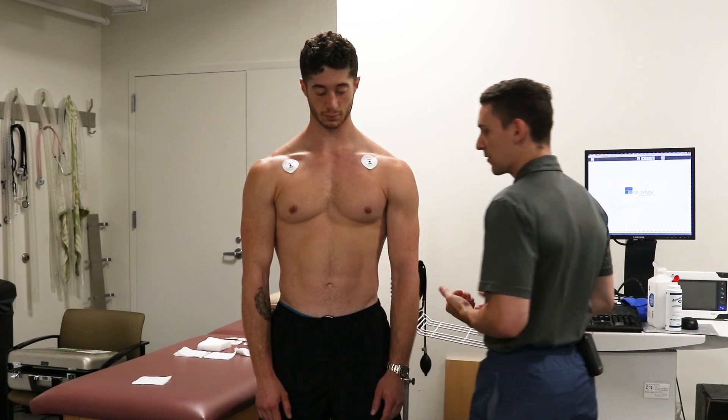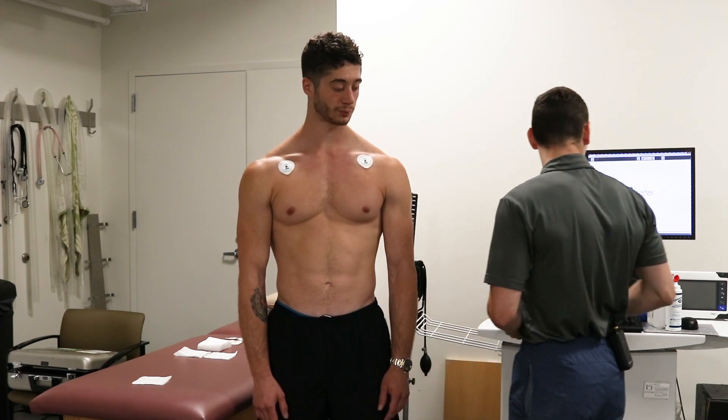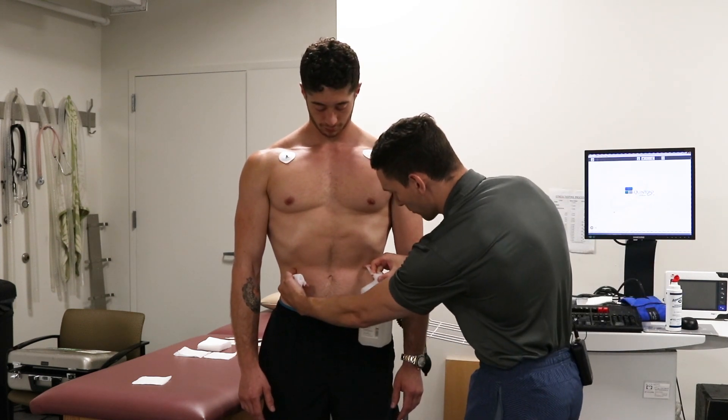We'll place our second electrode. The next one we're going to focus on is the right and the left legs. We start by asking our subject to suck in and inhale until we can see the bottoms of their ribs.